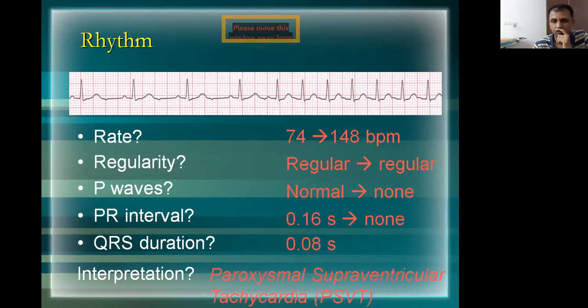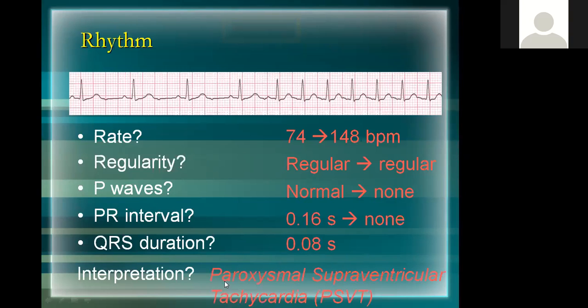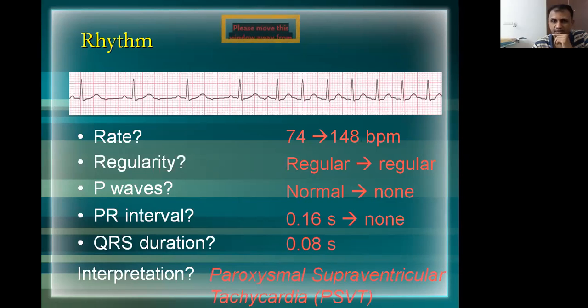It's called paroxysmal supraventricular tachycardia. Don't worry about the name. You will get familiarized once you start seeing more ECGs, or maybe in medicine, house jobs.